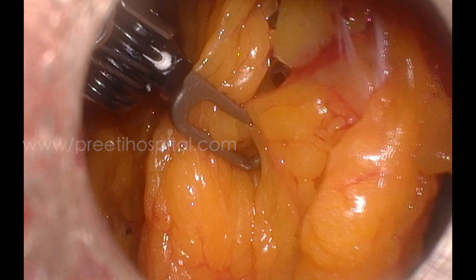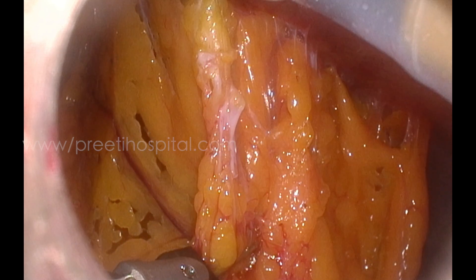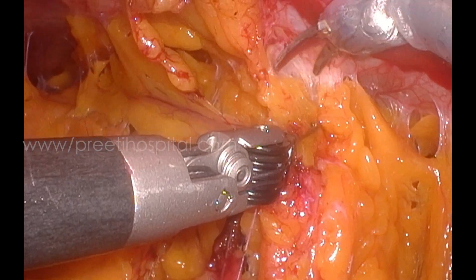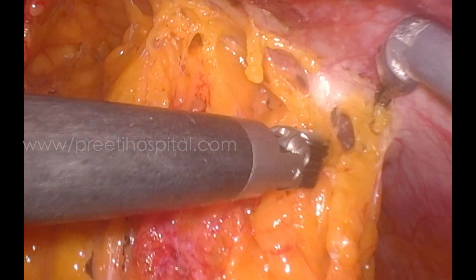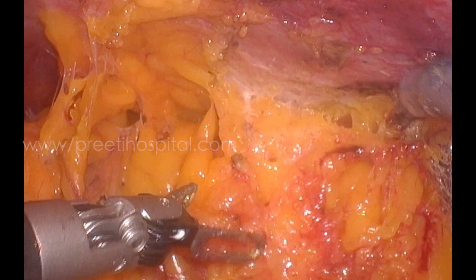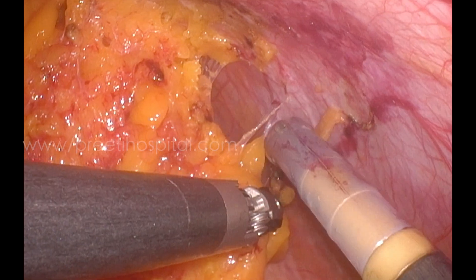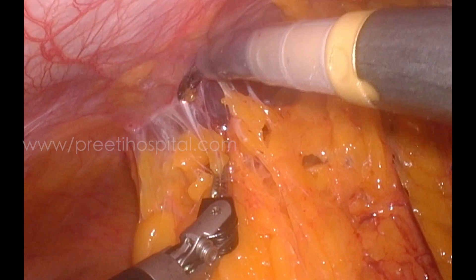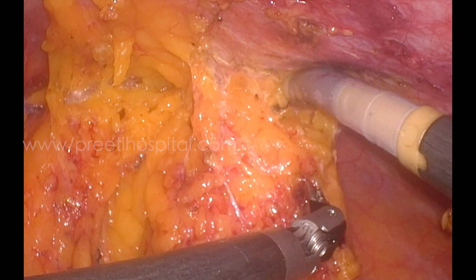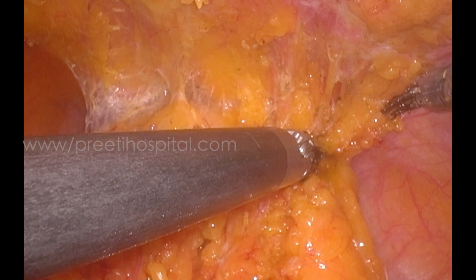Initially we faced the problem of adhesions, and the instruments were close together. In short patients it is better to place the camera more above the umbilicus — that is the first lesson for the future. After initial cutting I used the LigaSure cautery, which is very effective. This is a coagulative incision so it doesn't bleed — it cuts and coagulates simultaneously. I felt that surgery could be processed safely in this patient.